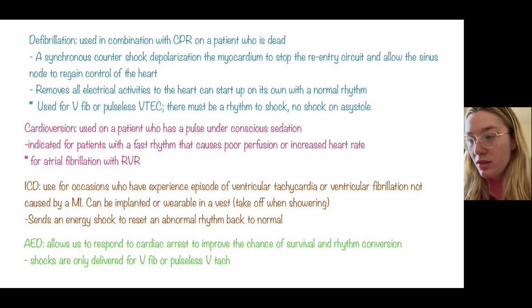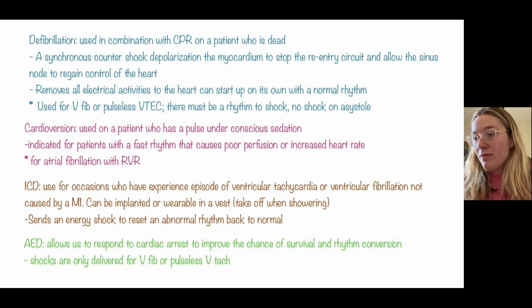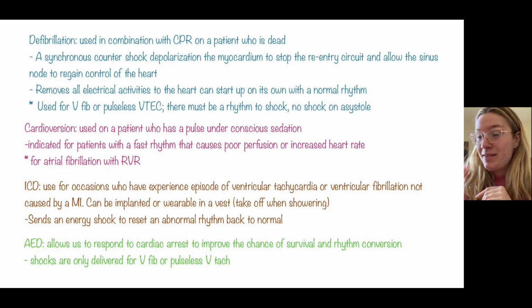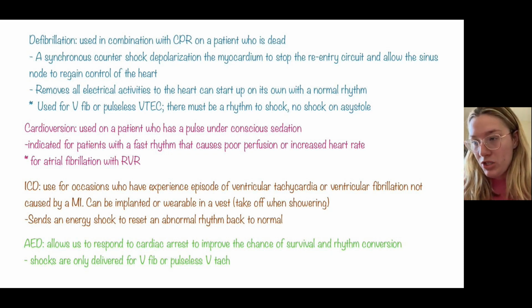Maybe there's an issue with the ventricles opening and closing, so they need a little bit of a reminder, a little bit of a shock: okay, time for me to open, time for me to go. Sometimes patients will be both if they have quite bad heart issues; they might be AV paced. And you'll see those pacer spikes on your EKG. At least in my facility, they're little purple lines, and you can tell where they are and what's happening.